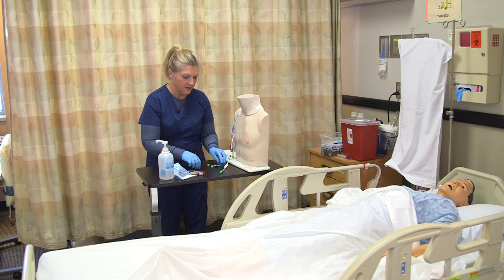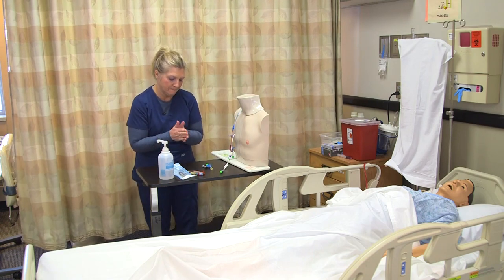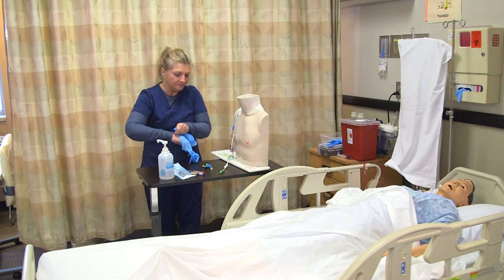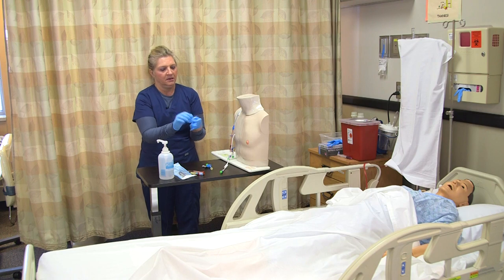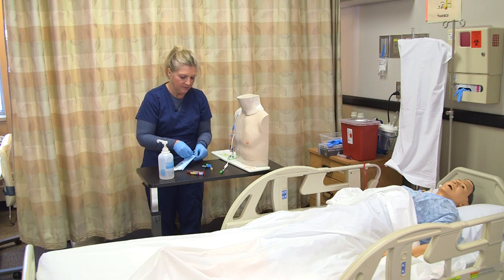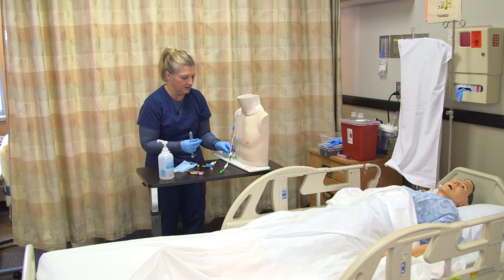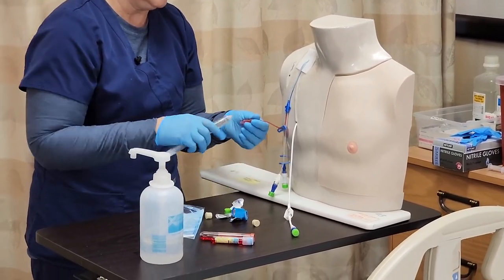I'm going to remove my gloves and wash my hands, then put more gloves on because I need to flush my port to make sure it doesn't clot off — I need to flush it and lock it. I grab my sterile saline and disinfect my port again vigorously for at least five seconds.